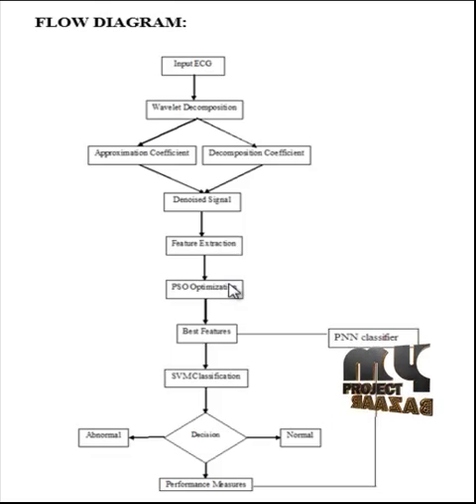Similarly, for the comparison of the efficiency, genetic algorithm is also used. Comparing with the PSO algorithm, genetic algorithm is an existing method. In PSO, the accuracy will be improved. From the selected best features, then the classification process is done.